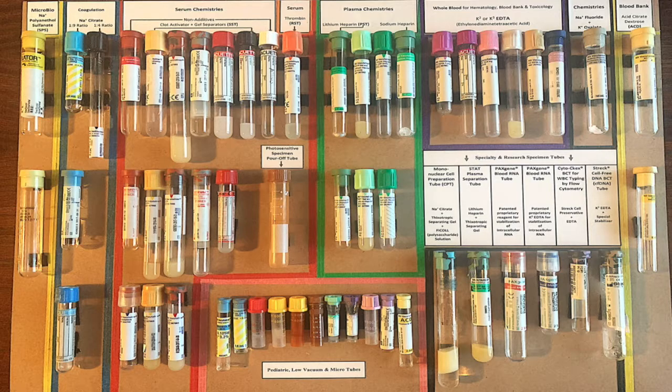But how do you know what to draw when you need to draw it? It's mapped out for you. Your requisition will clearly state and show you the color of the tubes and the order they need to be drawn in. Pretty easy, right?